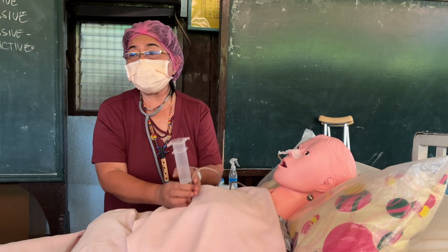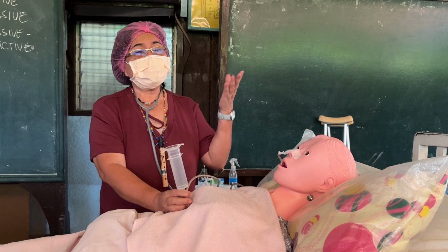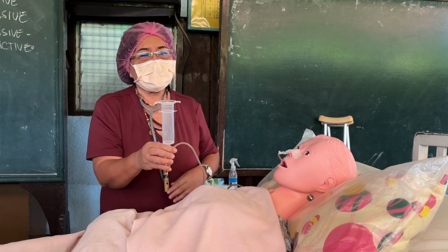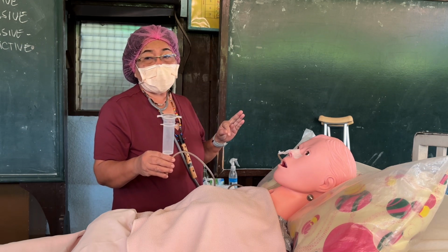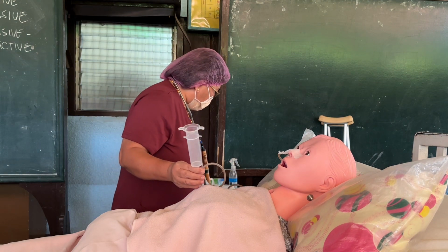Flush with 30 ml water before and after feeding. Okay, before you start feeding, class, you flush with 30 ml mineral water. Okay, flush with 30 ml water before you start feeding. Now, after the feeding of 180 ml, two pieces of medicine. Now, 30 ml again. Let's divide our water now. 10 ml of water first.